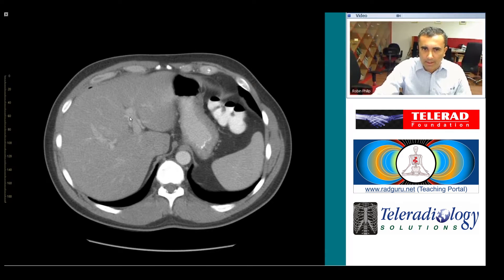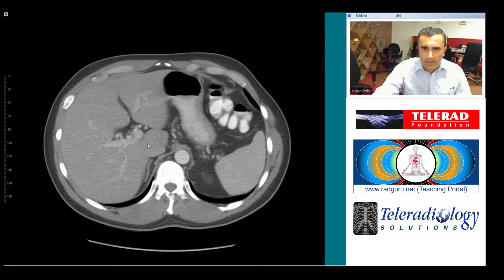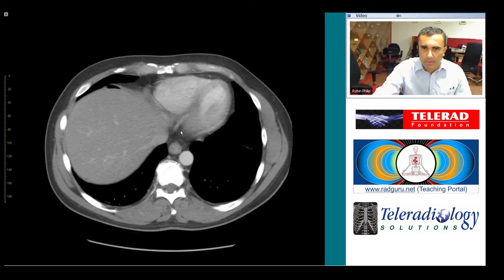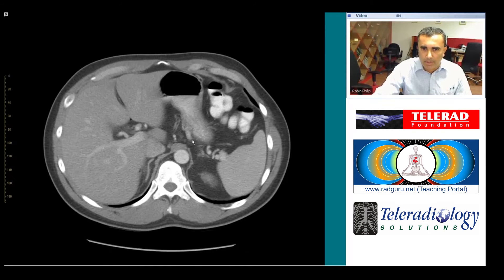And of course there is another loculus here, interposed between the liver and the diaphragm, and a second larger one up under the diaphragm as well.